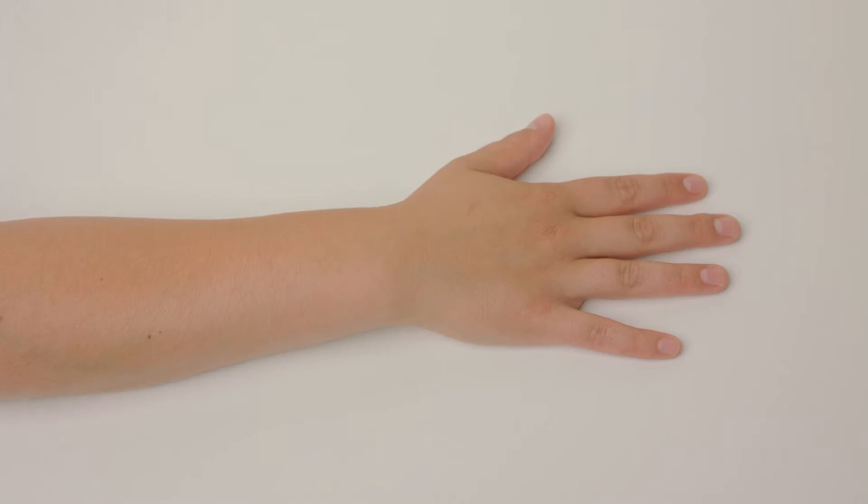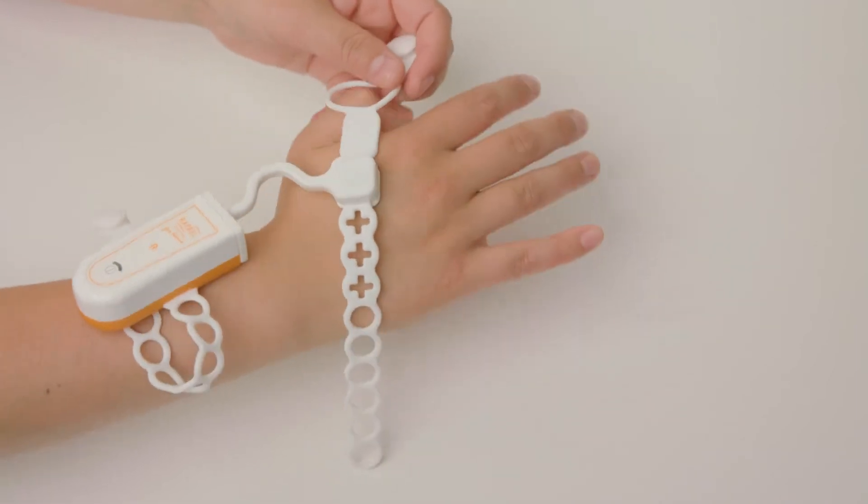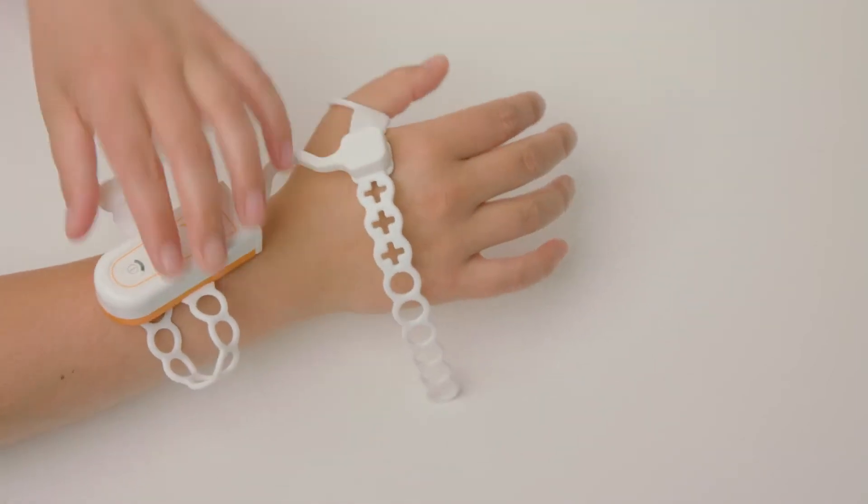Donning the glove is as easy as one, two, three. First, place your thumb through the large oval hole and rest the plus signs across the back of your hand.